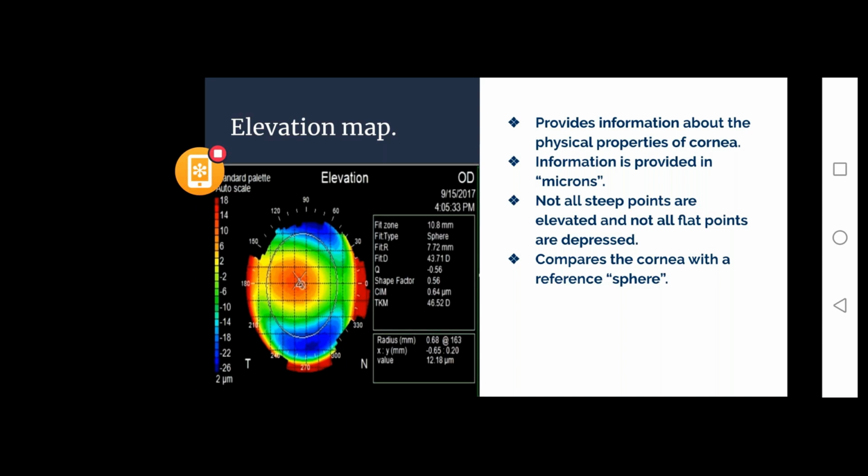In geography, what do we see whenever there is a mention of plateaus or hills or mountains? For example, Mount Everest. The peak of Mount Everest is sometimes written as XYZ meters, but meters from where? I'm sorry, I don't know exactly how high Mount Everest is. Suppose it says 2000 meters above the ground, so it is saying above the ground, right? So the ground is taken as a reference.